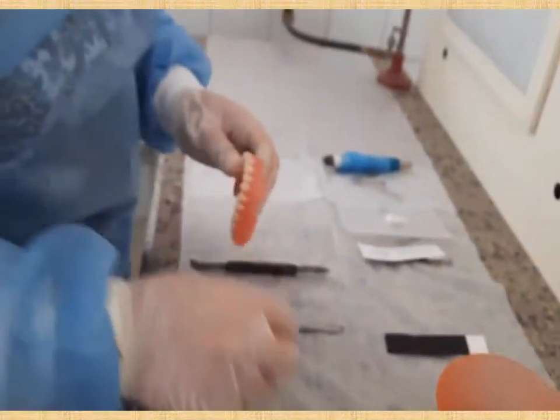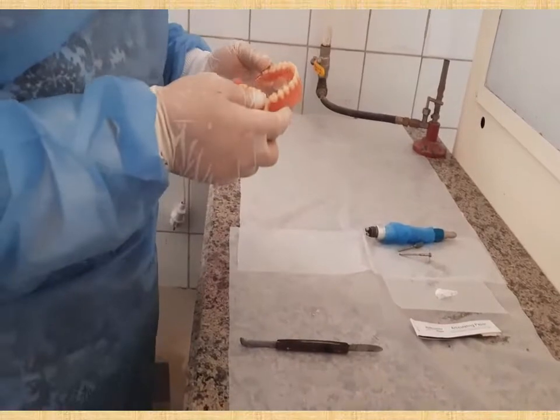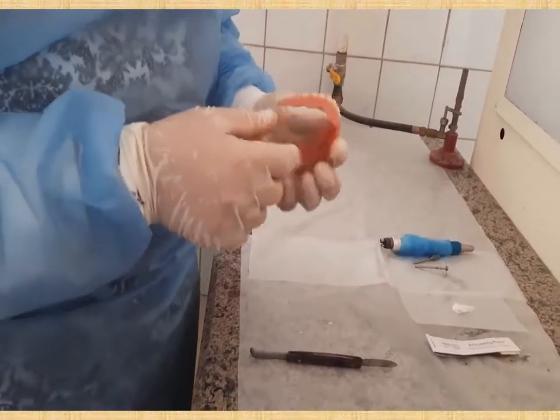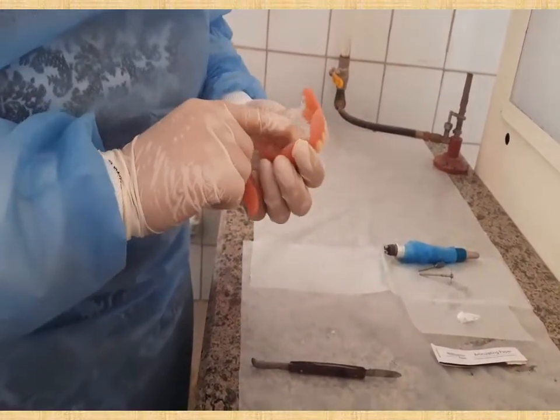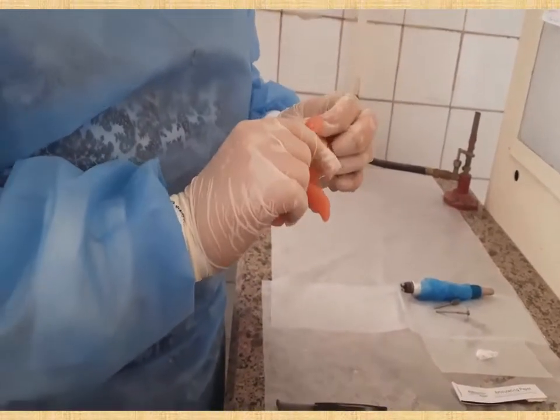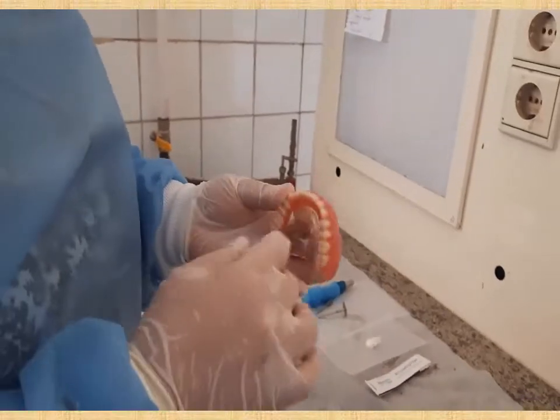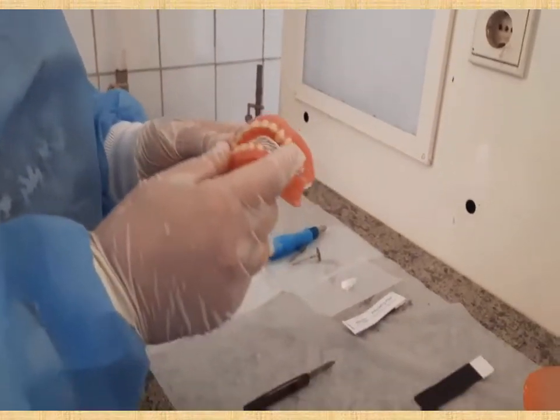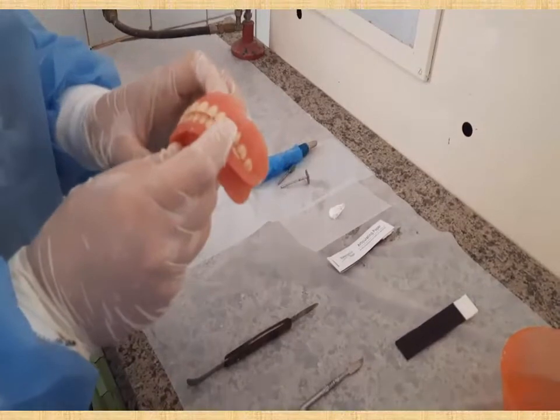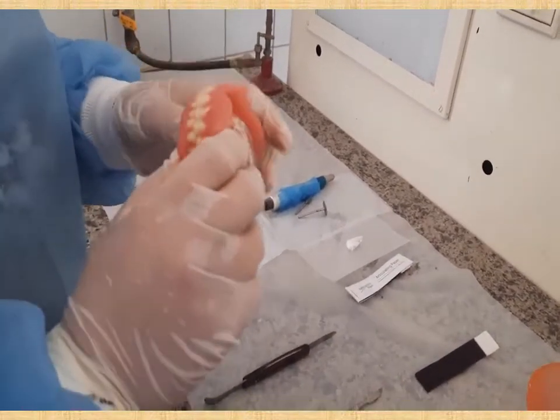This step is very important. You have to check for any abnormalities regarding the fitting surface, such as sore spots and pressure areas, any roughness regarding the periphery or polished surface, and also check aesthetics and phonetics regarding the patient, patient approval of the denture, and give instructions on limitations of the denture.